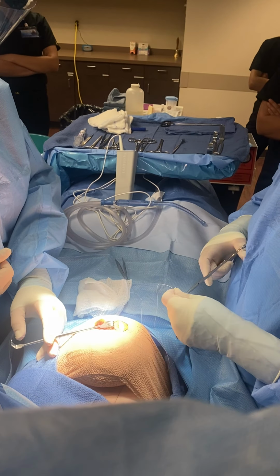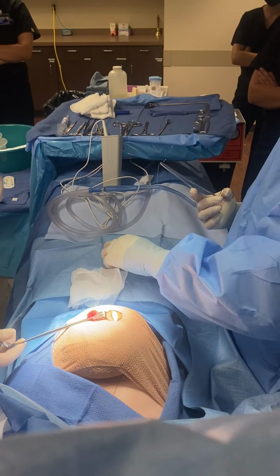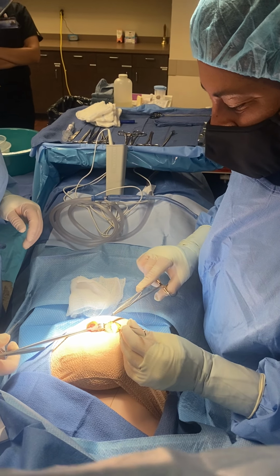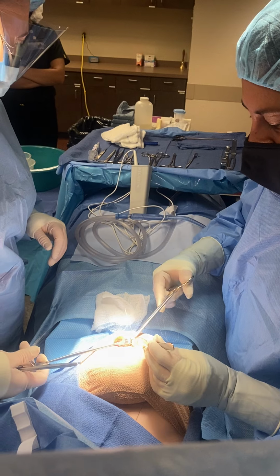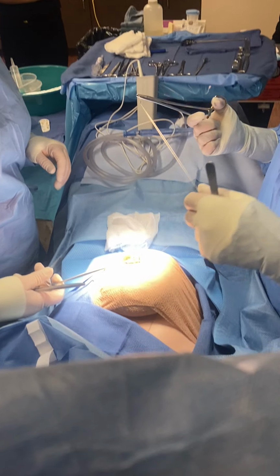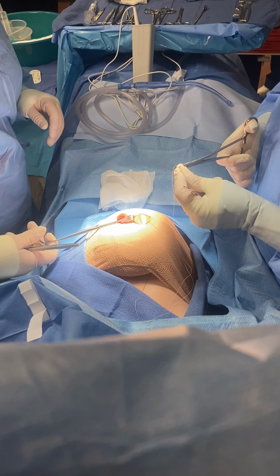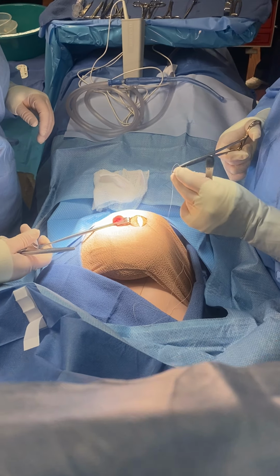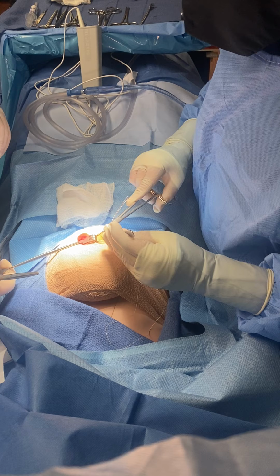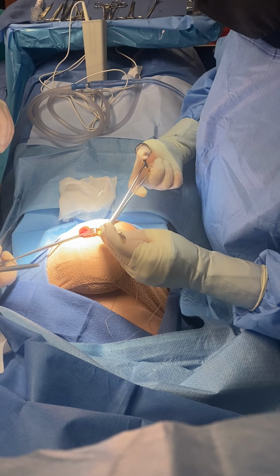What would you like for dressings? Yeah. It's on my card. I think she likes Steri Strips, Telfa 4x4, but I can't remember what size the Steri Strips are. I think. Is a half inch good, Doc? I like half inch. Perfect. This will work. And how about Mastisol? Sure. Since we're gonna make this incision look as nice as possible. I saw your preference card isn't right. We'll get it figured out so it's right next time.